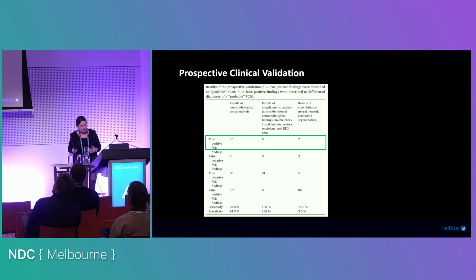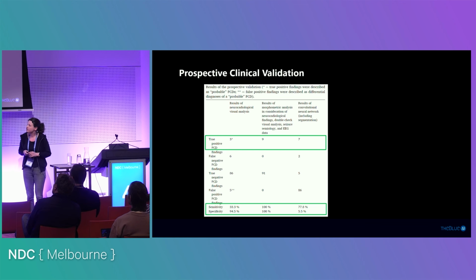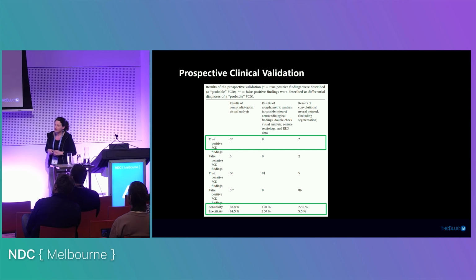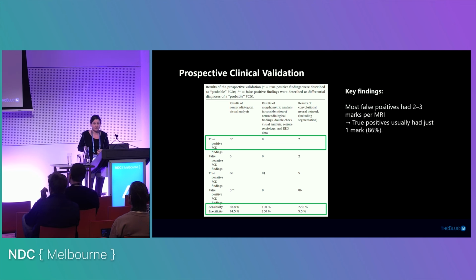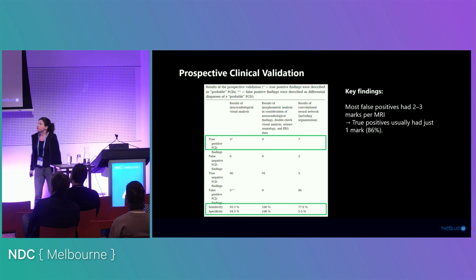So we were quite happy about it, but until we also saw the next feature that is presented here, meaning that we recognize almost 80% of the cases right, but the specificity was very low, meaning that our model very frequently was saying that there is some kind of FCD, where in reality there wasn't. So we decided to analyze it a little bit deeper and see what happened here.